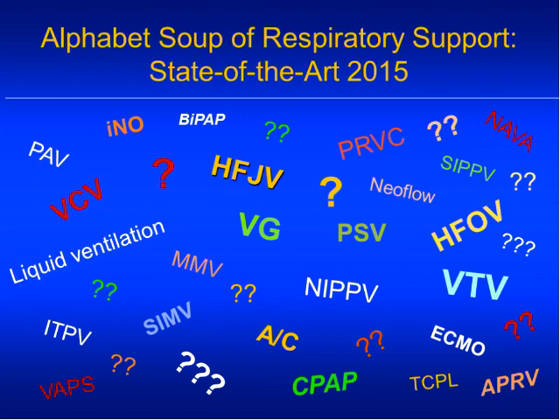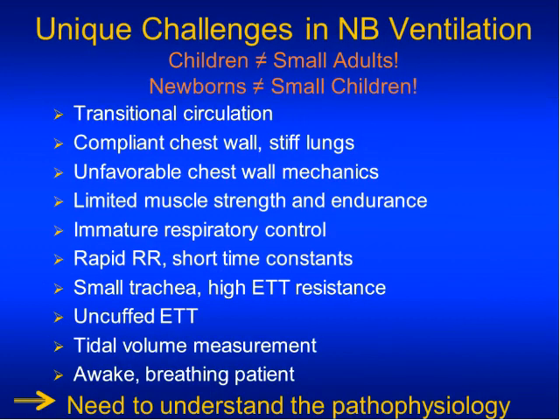You're all familiar with most of these little acronyms. We have a virtual alphabet soup of acronyms describing lots of different modes of ventilation and devices at our disposal, and the engineers have done a fine job in making gadgets for us to use. Our understanding of when and how to optimally use them, however, is still lagging in some areas. So let's try to sort some of these things out.